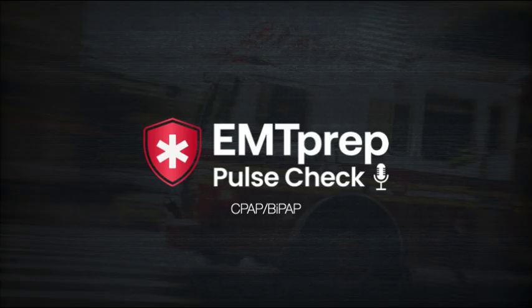Cardiac arrest would also be a correct answer. We would not want to use CPAP or BiPAP in cardiac arrest. At that point, we're going to be using a more invasive airway management technique. Again, a patient in cardiac arrest will not have respiratory drive, so this won't be useful.